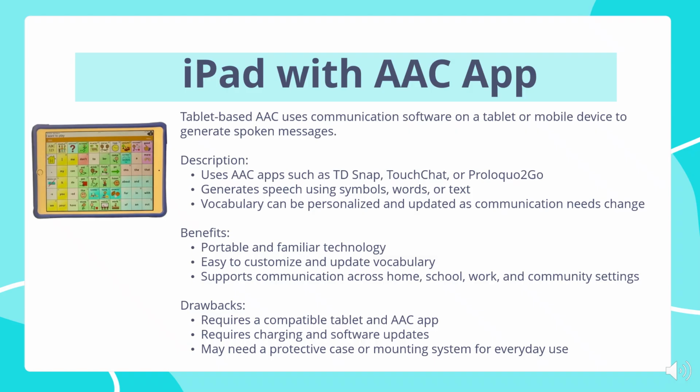One of the biggest advantages of tablet-based AAC is that it uses familiar and portable technology that some individuals may already have in their homes to support communication across home, school, work, and community settings. However, tablet-based AAC requires a compatible tablet, regular charging, and software updates, as well as the additional cost of AAC apps. Many users also benefit from a protective case or a mounting system for everyday use.